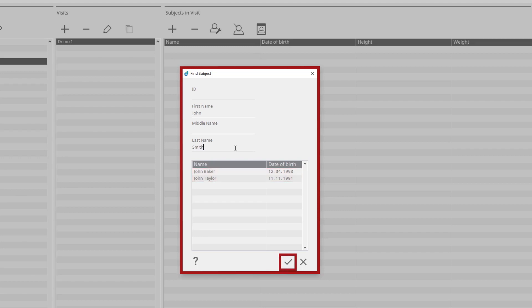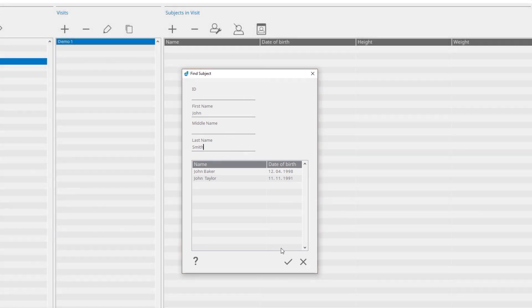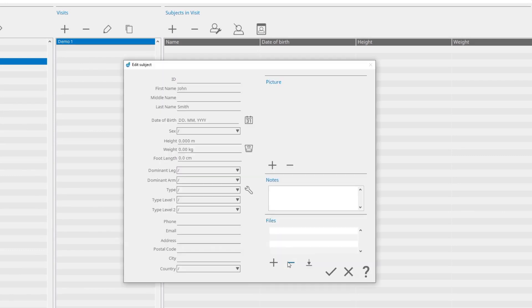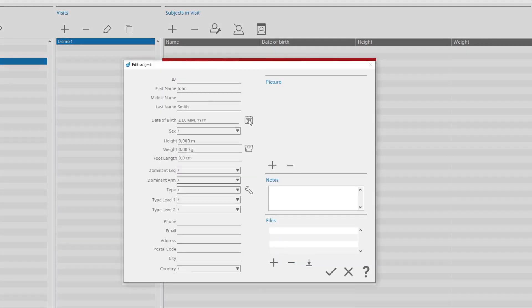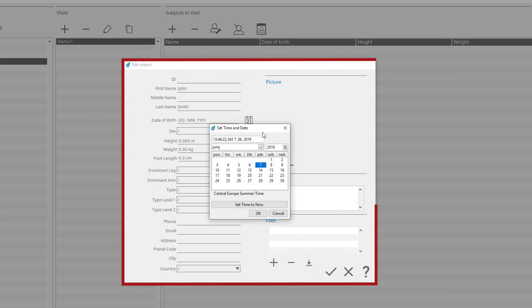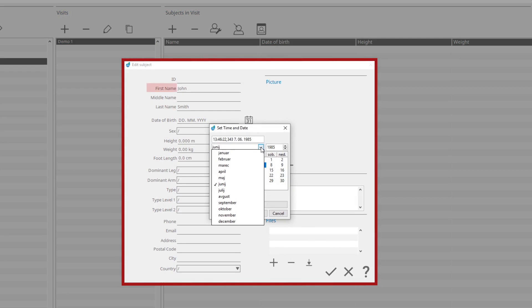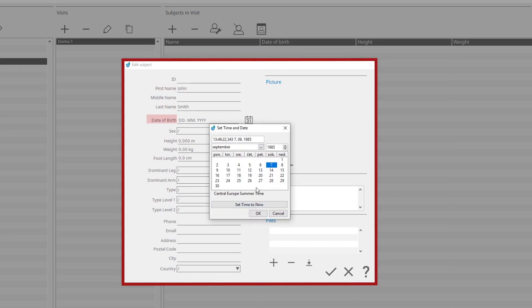If the subject already exists in the database, select it from the table below and click Confirm. In the Edit Subject window, you can create new subjects by defining the subject's last name, first name, date of birth, sex, or subject ID.